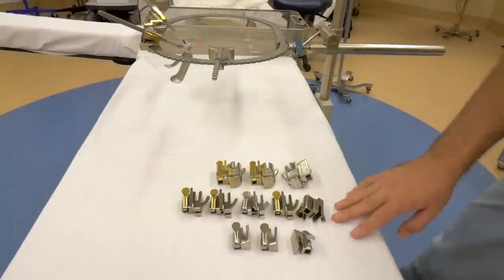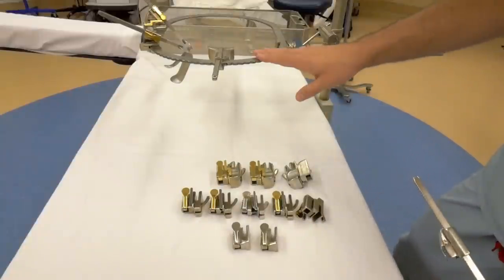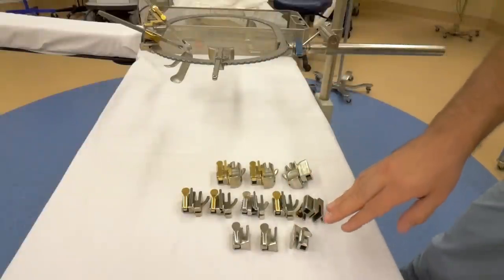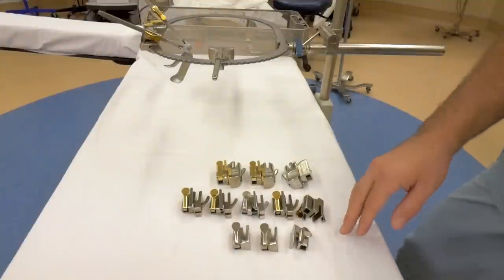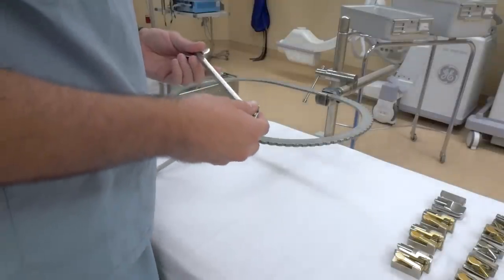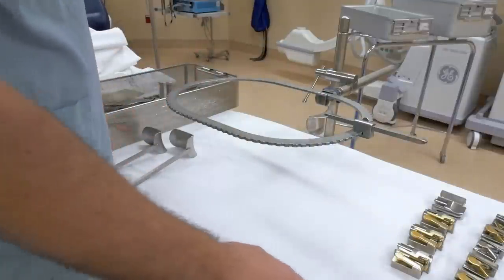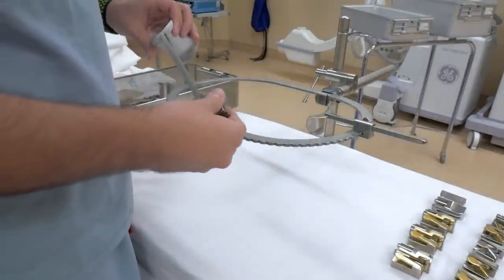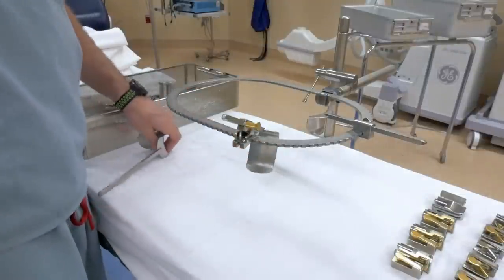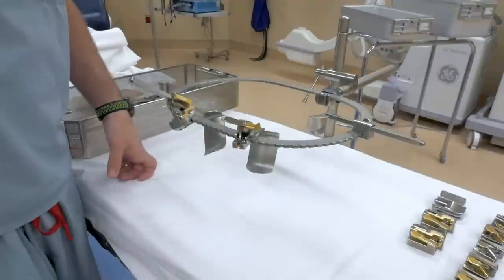These are the ratchets in your Bookwalter set. These ratchets are used to hook a retractor to the ring of the retractor system itself. There are three types of ratchets in each set, and each basically gives a varying degree of retraction and angle. Starting with the smallest ratchet: single action, double action, and triple action.